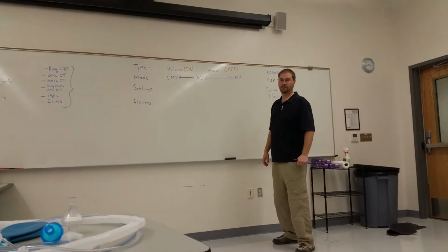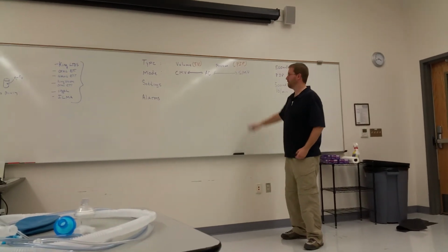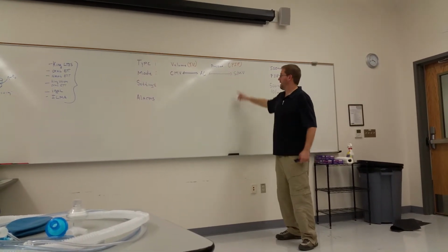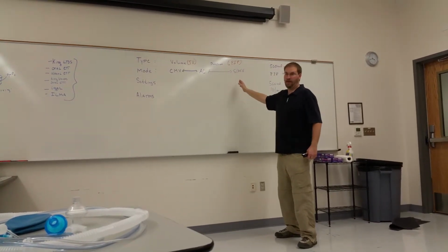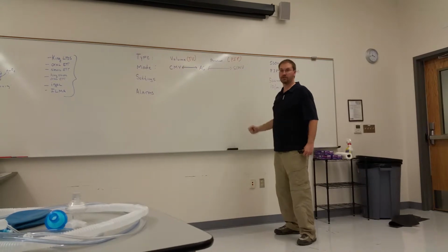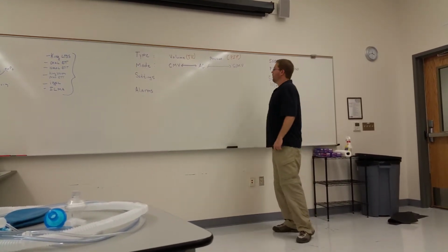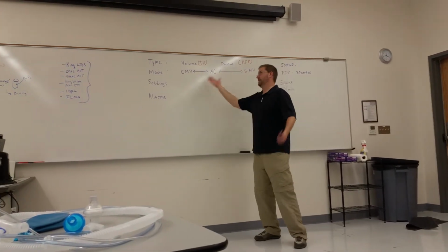Yes, sir. But on SIMV, you still set rate and volume, and then if you want to take an extra breath, it allows you? Yes, you have a backup rate and volume. And then whatever the patient does above the ventilator, it lets the patient do it. So here's the question. What mode is best? SIMV.